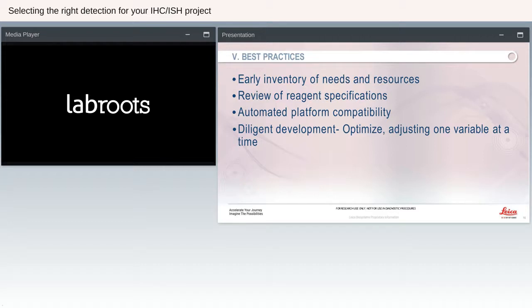And then the final one, absolutely hands down, being diligent in development. So optimizing things one thing at a time, good scientific method, and adjustment of just one variable at a time as you're going along will produce the best quality outcome.